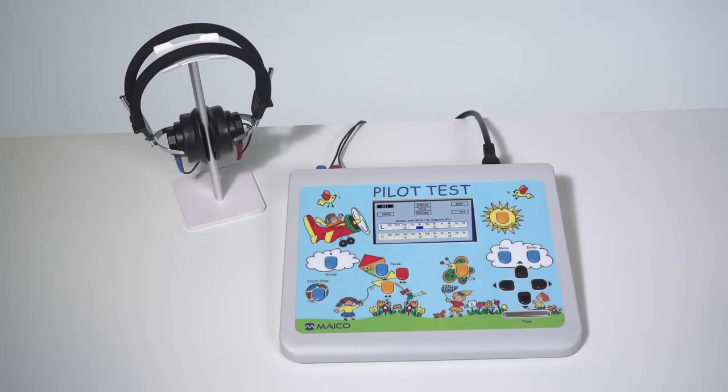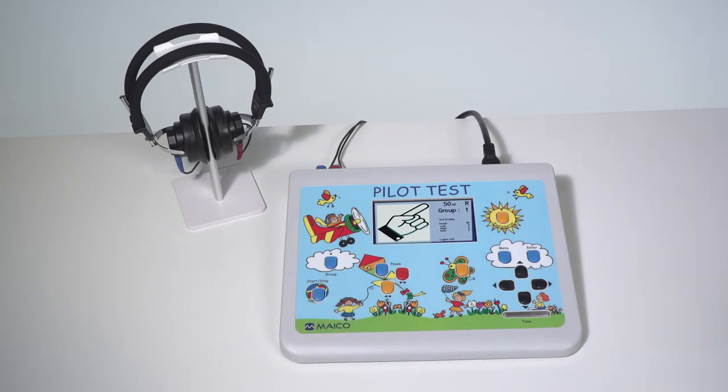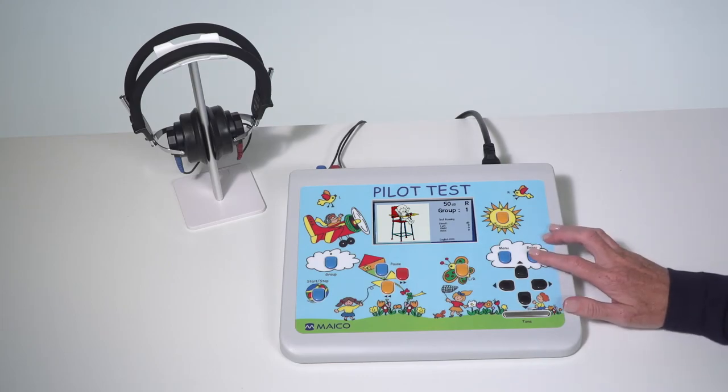When performing select picture audiometry, select or confirm the group list button in the cloud. Start the test by selecting the start and stop button located in the ball. When the correct picture is selected by the child, press the enter key to score the level.